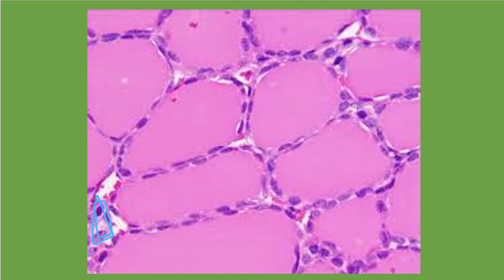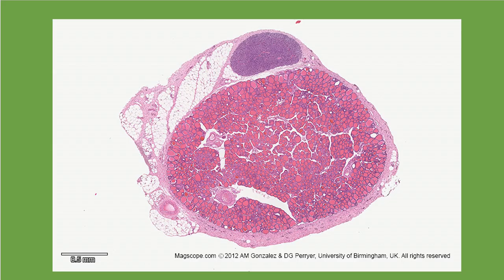Now, if we looked at this image, which is a broader view, you can still see our little bubbles in here. But what you see on the outside over here, this dark, we talked about those characteristics, it's always going to be a darker shade than your thyroid hormone. So this would be our parathyroid hormone here. I mean, parathyroid gland, I'm sorry.